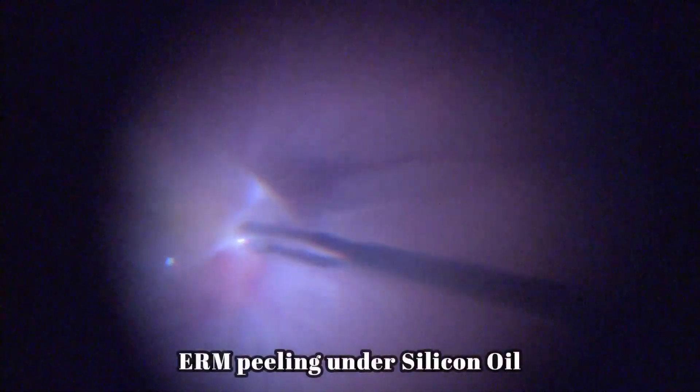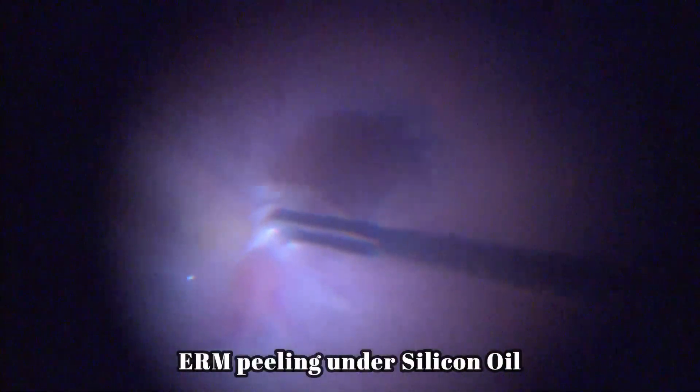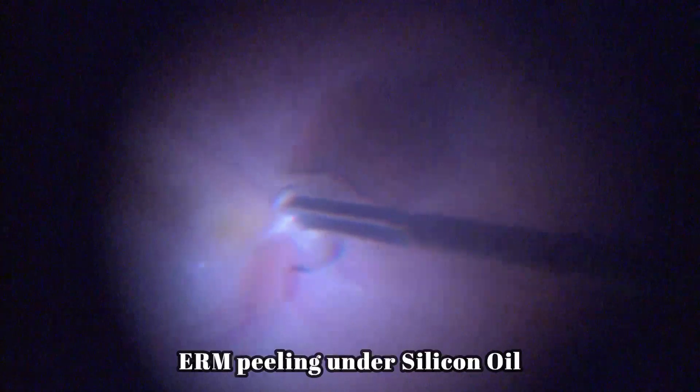Another case of ERM removal under silicone oil. In this case, we are not removing the oil. The membrane is being removed under the oil. You can see the reflex of the membrane under the oil, which is peeled off from the underlying retina.